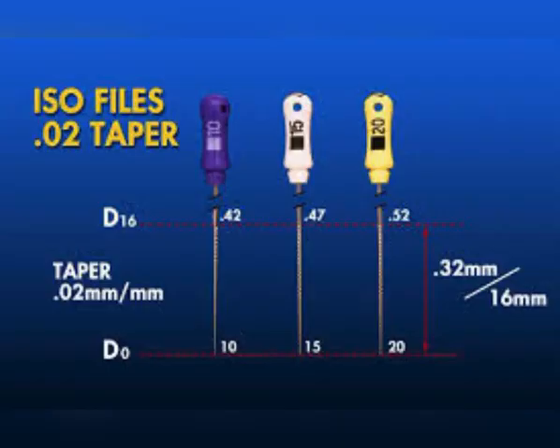So if you take a 10 02, D0 is going to be 10, D1 is going to be 12, D2 is going to be 14, and D3 is going to be 16. Apparently, I mean to say that a 2% incremental rise is seen. So 10 02 is going to be 10, 12, 14, and 15 02 is going to be 15, 17, 19, 21.